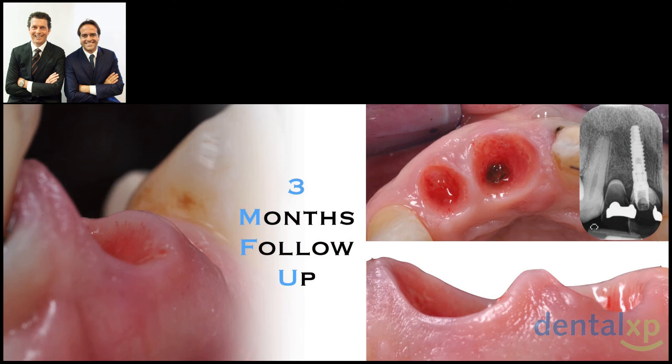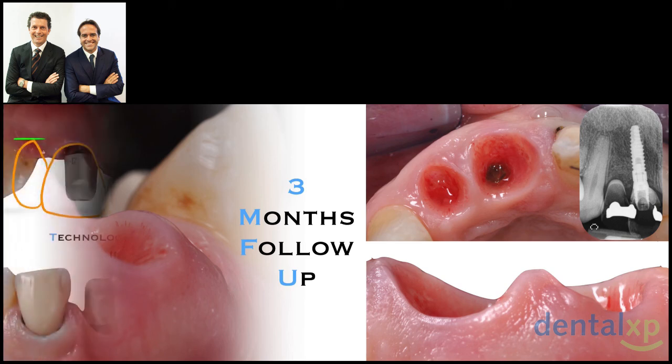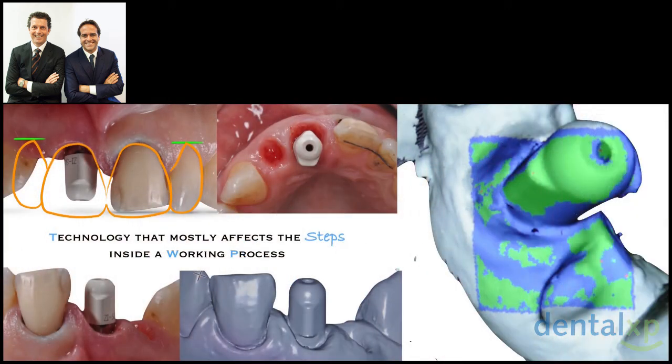Yes, the proper implant position, together with a combination of bone and connective tissue graft, will permit us to maintain the root profile and especially the interdental or interimplant papilla of this very challenging case. And at this point, of course, we can incorporate once again what? We can incorporate new working tools such as digital impression to copy and replicate what we have clinically.